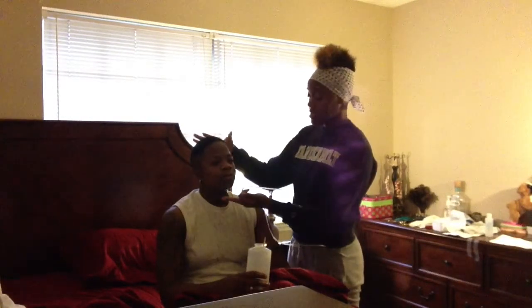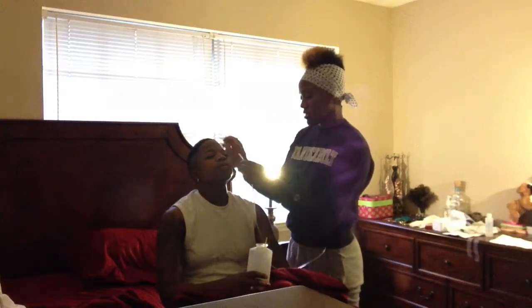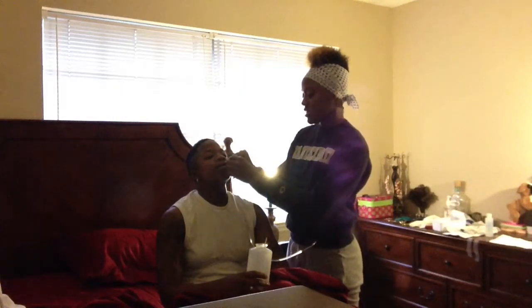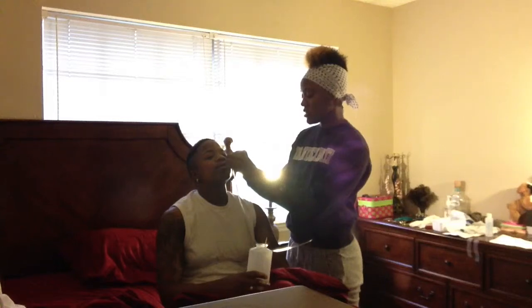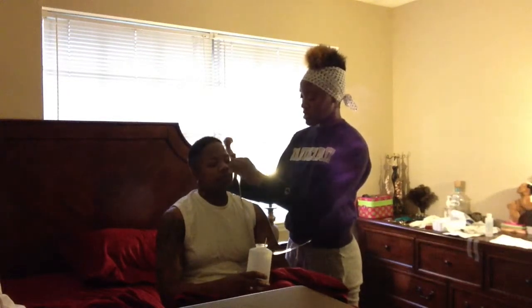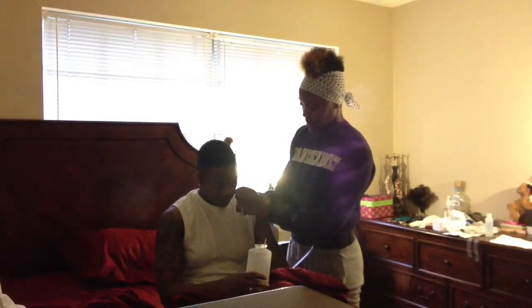Oh, well, no, actually, before I do that, I also want to check Ruby for gag reflex. So now we're going to ask Ruby to hyperextend her neck. And Ruby, breathe through your mouth. And so I would insert the tube until I begin to feel tension, and I would ask Ruby to lower her chin to her chest and swallow, and you can use the water if needed.